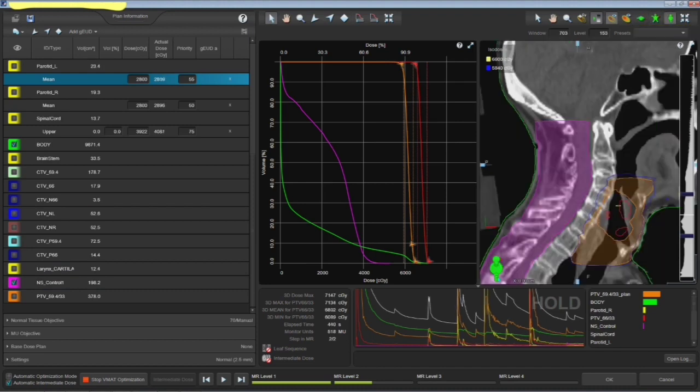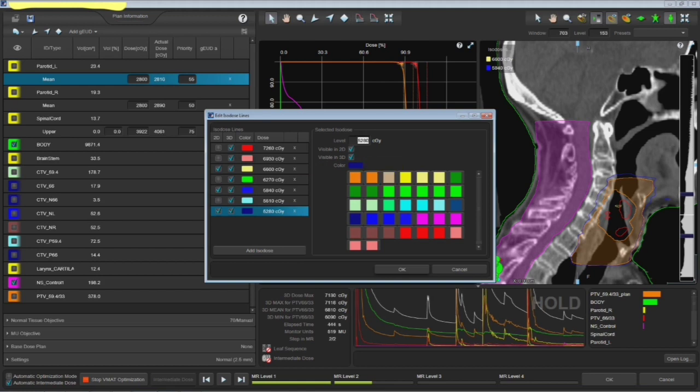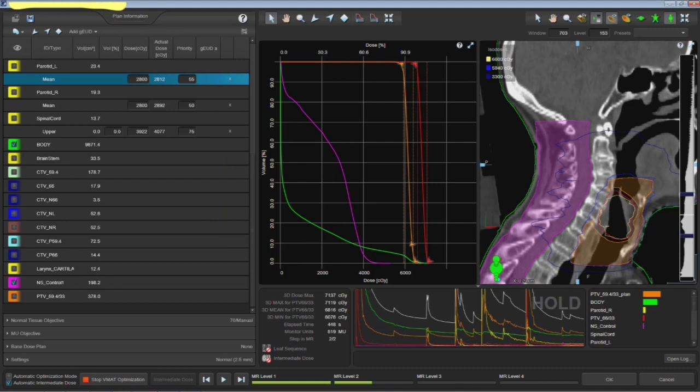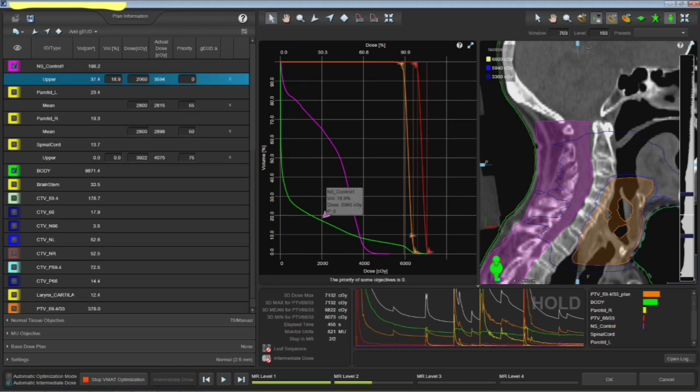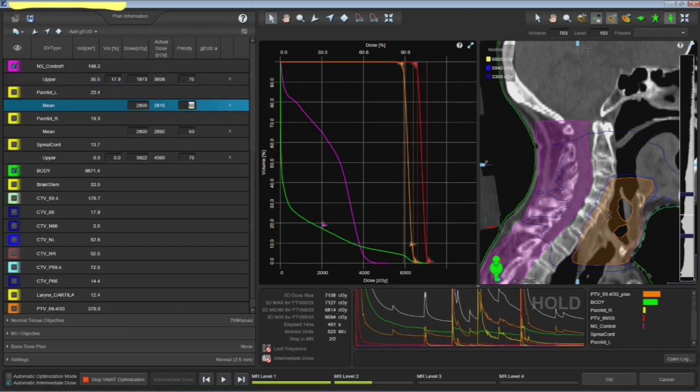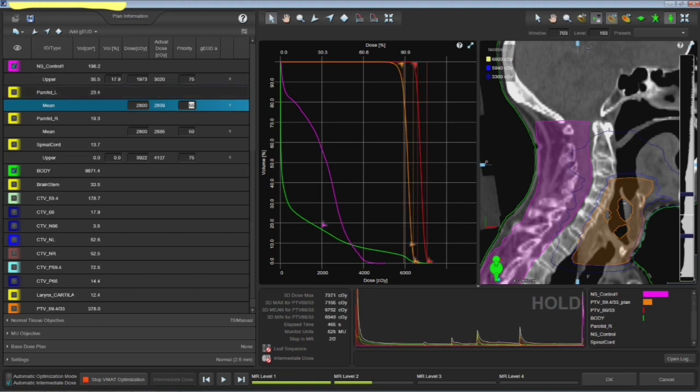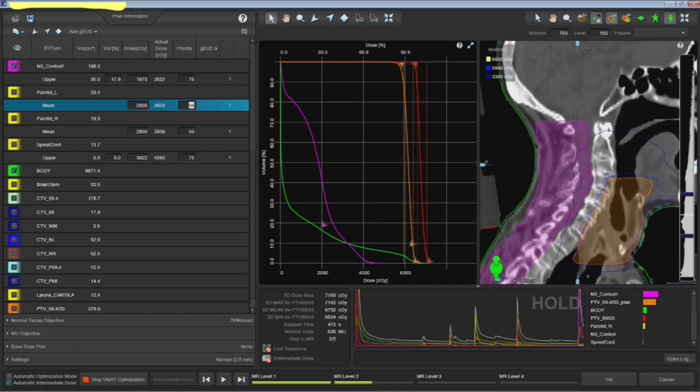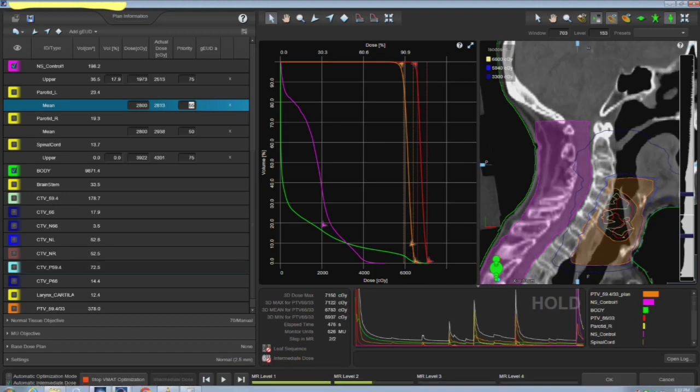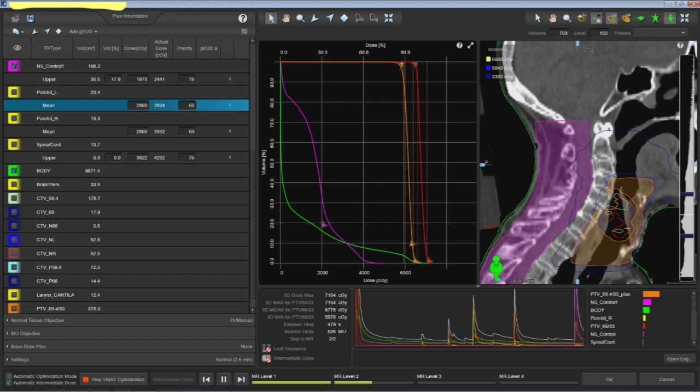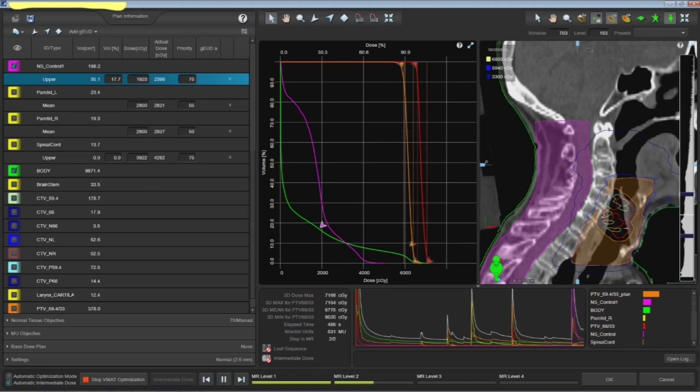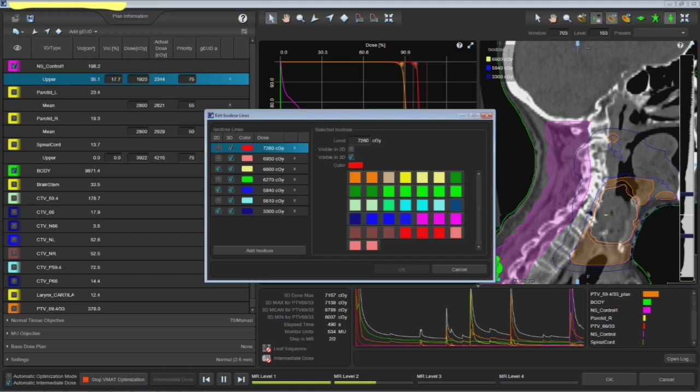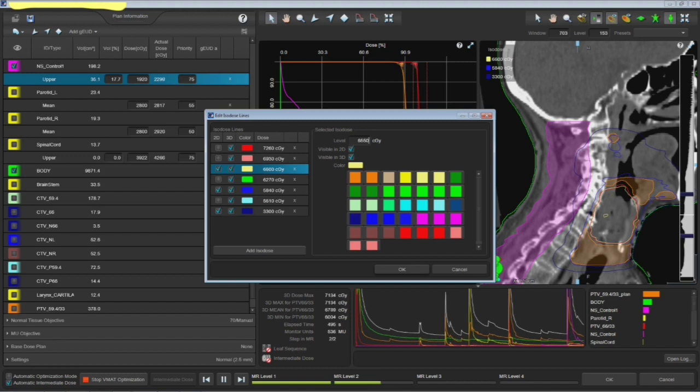And then the posterior neck region, soft tissues, one can really reduce that. Go for the 50 percent dose curve and then the aim should be that 50 percent should not fall into that. It's not possible in all the slices but majorly. It's not possible in all the slices as I said, but majorly the 50 percent spill could be controlled.